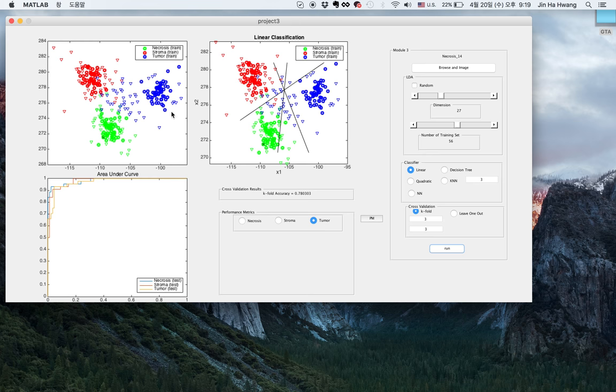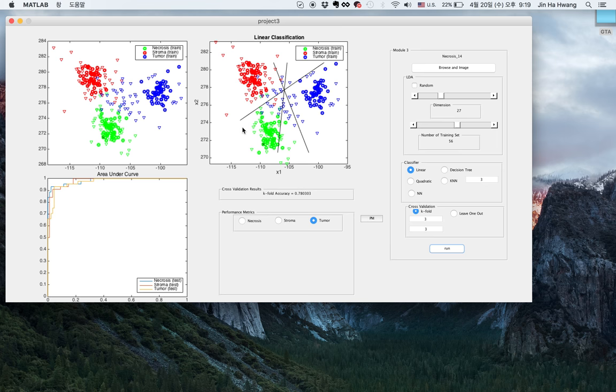Here is the result from the LDA classifier. As you can see, necrosis is green, stroma is red, and tumor is blue. Here is the result from the linear classification with lines separating the different classes.